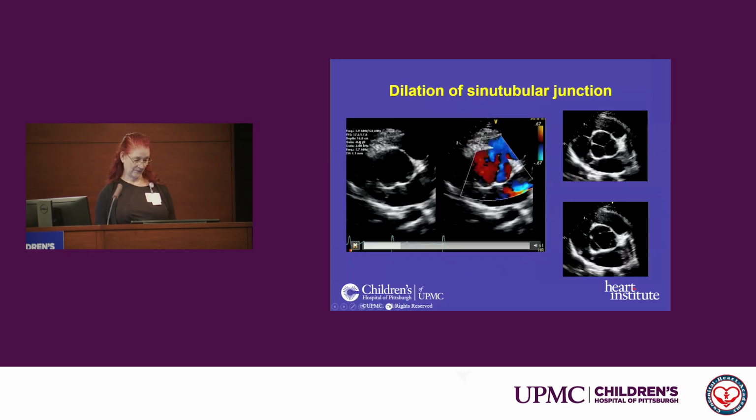And this is an en face view of the three leaflets. The leaflets themselves look beautiful, but we're beginning to see central and actually a little bit of eccentric aortic insufficiency.